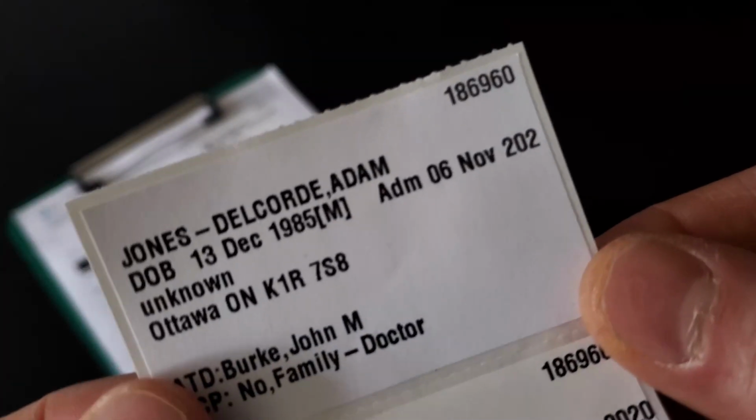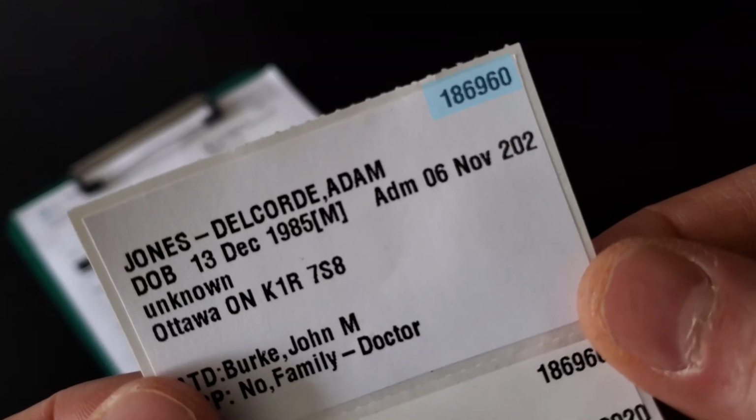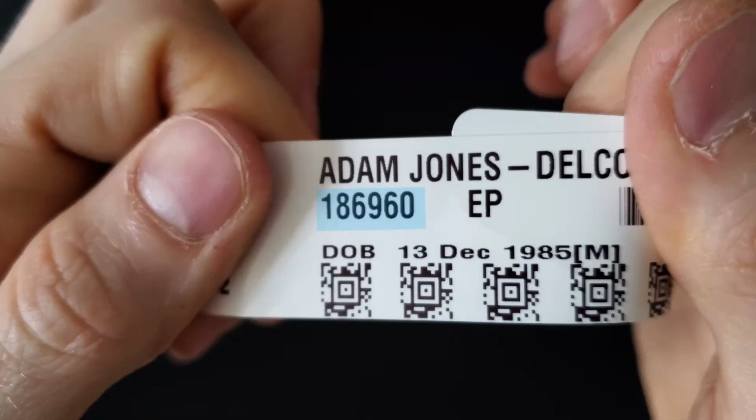Once you've saved your images, you'll need to associate them with some patient information so that we could go back and follow up on that patient if we ever needed to. If you're in the hospital, all you're going to need is the patient's chart number, which you could easily find on any of the patient's stickers. And if you're doing this at the bedside, you could find that same number on the patient's wristband. You just got to know where to look.